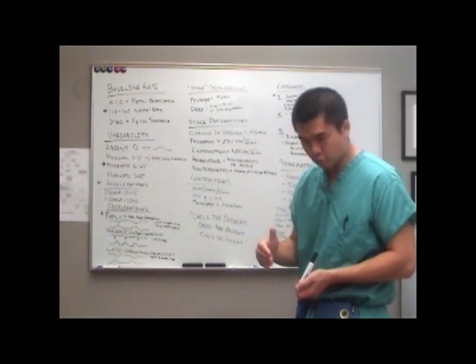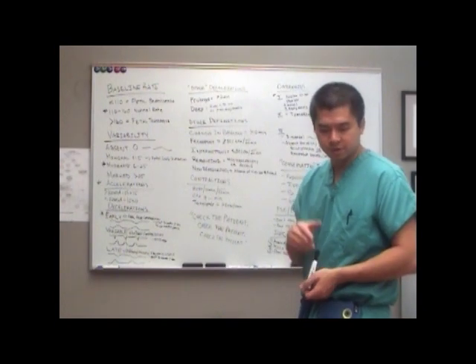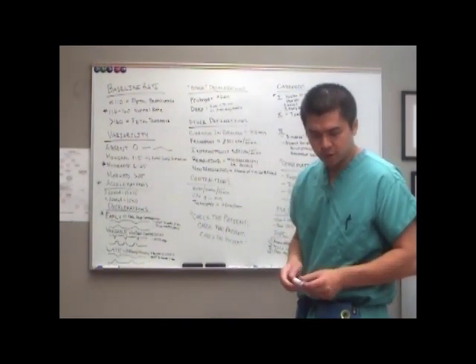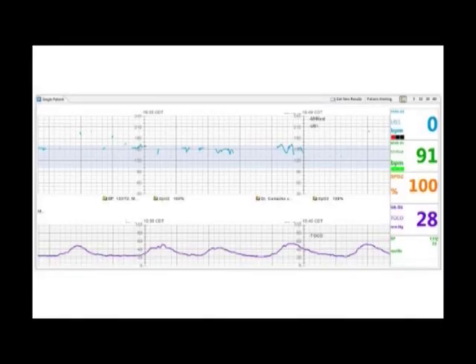It'll be more gradual than that. So if it's 90 degrees, it's more likely dropping down to mom. But in this example, you don't even have enough to really say that baby's heart tones are reassuring. So this might be an example to put in an FSE, or a time when you would want to, if you indeed cannot get the baby on the monitor.